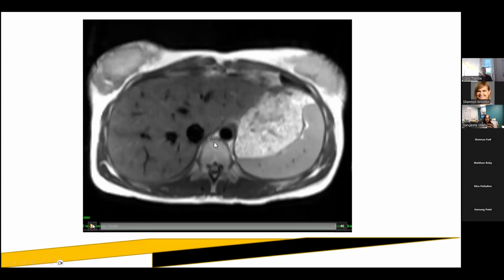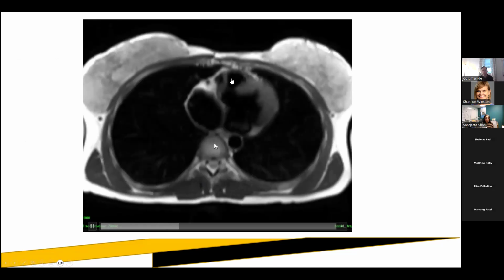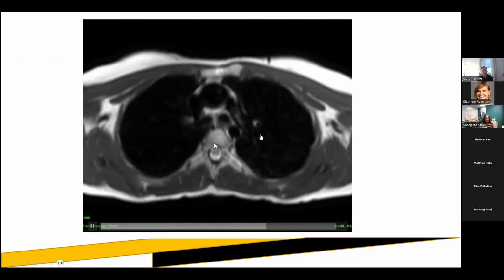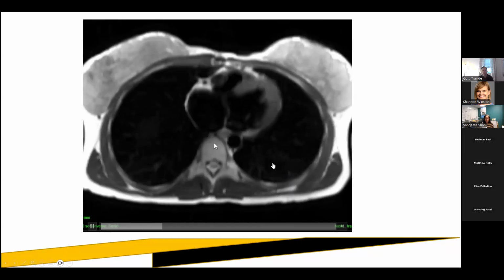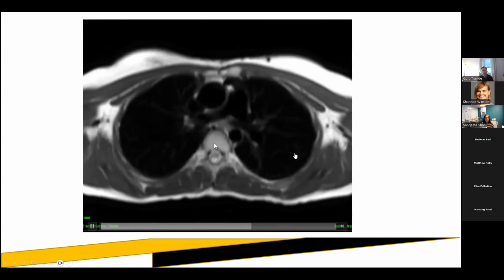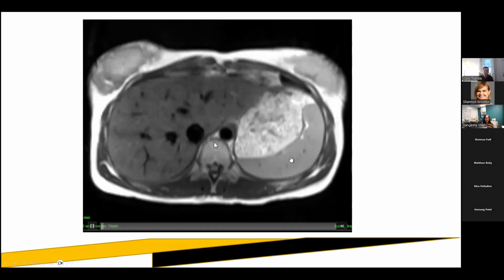So I'm going to try to do anatomic first, and then we'll go into just showing the location of everything. So here's the liver, aorta, right atrium, right ventricle, aorta, and PA bifurcation. So I'm going to let this play once more. In this individual, anatomic locations are correct. You have concordance between the right atrium and right ventricle, and concordance between the left atrium and the left ventricle.